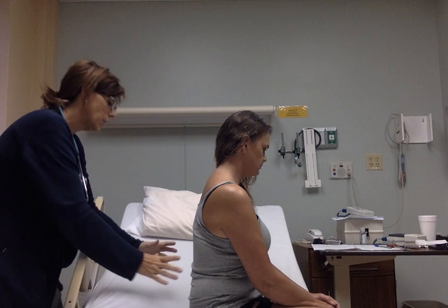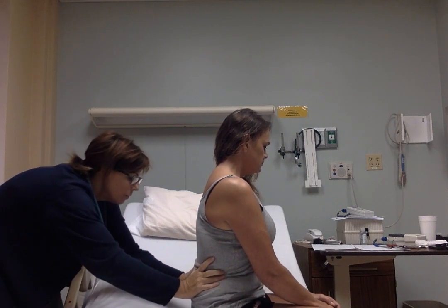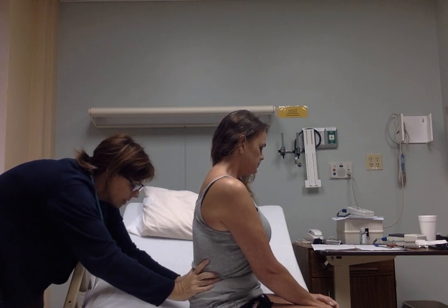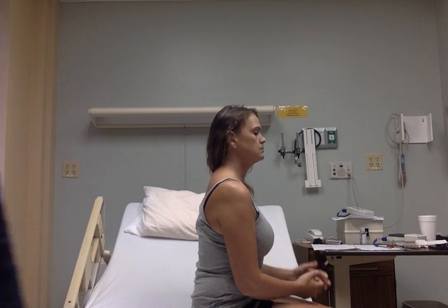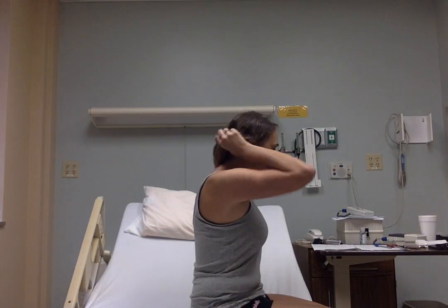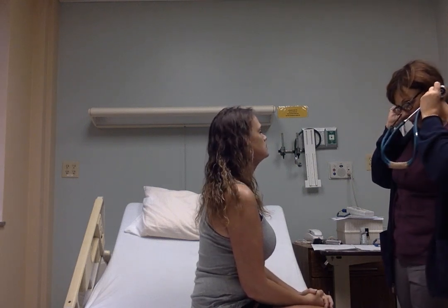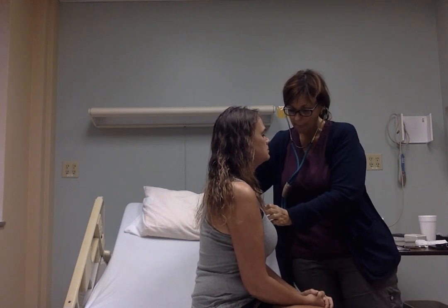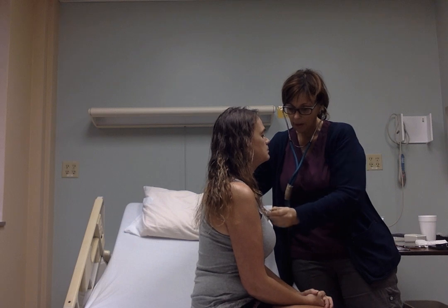All right, we're also going to look at her thoracic symmetry, and I'm going to check and make sure it's even. I want her to take a big, deep breath so I can make sure everything's even. Excellent. All right. I'm going to come around to the other side. We're going to listen to her heart, and we're going to listen to the aortic sounds here. Pulmonic.